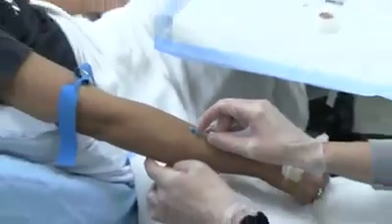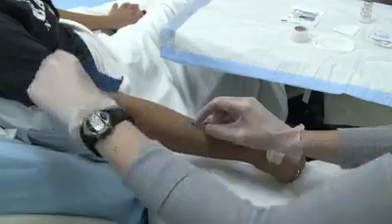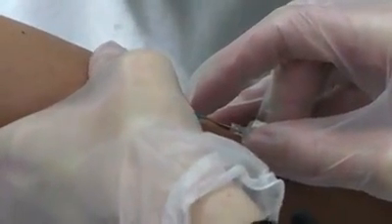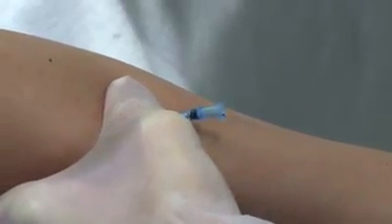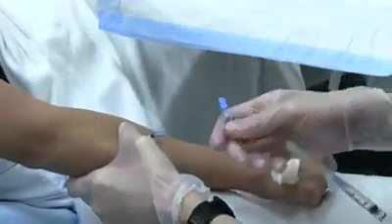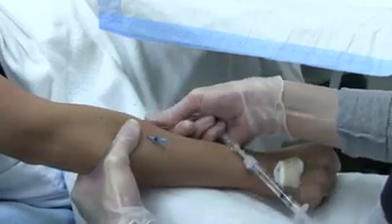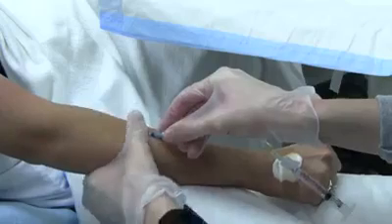Hold the needle assembly in a steady manner. Advance the catheter until the hub is at the venipuncture site. Release the tourniquet. Carefully remove stylet and engage the needle safety device, and immediately put pressure on the vein proximal to the catheter to eliminate or reduce blood oozing out of the catheter.